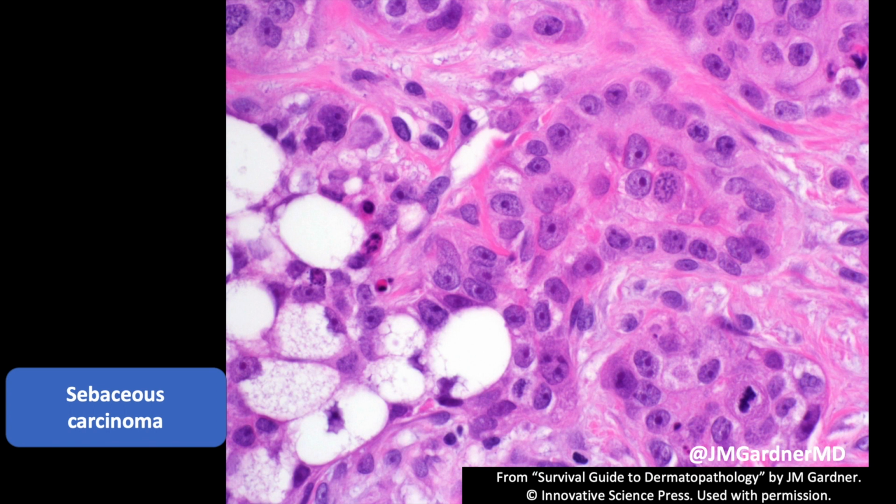And the one challenge I find with sebaceous carcinomas is they often are one of two things. They're either obviously malignant, but I'm not totally sure if they're sebaceous or not. These pictures are pretty obvious, but there have been many cases in real life where I never could quite find a perfect sebocyte. So you have obviously ugly tumors that are clearly carcinomas, but you're not sure if they're basal cell, squamous cell, or actually sebaceous carcinoma. At the other end of the spectrum are the very well differentiated sebaceous carcinomas where you can tell clearly it's sebaceous, but you're not totally sure: is it malignant, or is it just a big, large sebaceoma or sebaceous adenoma?